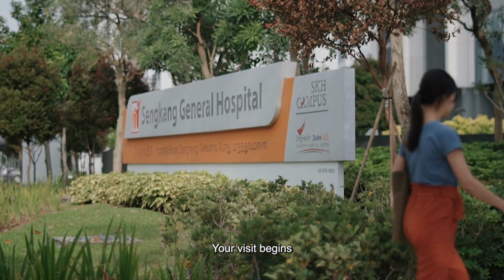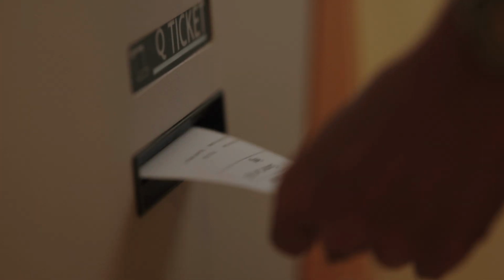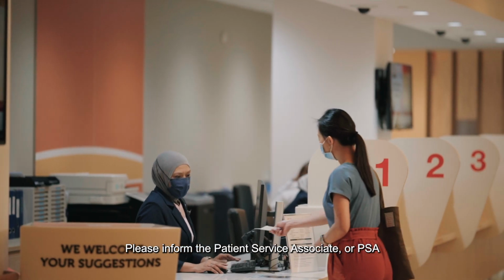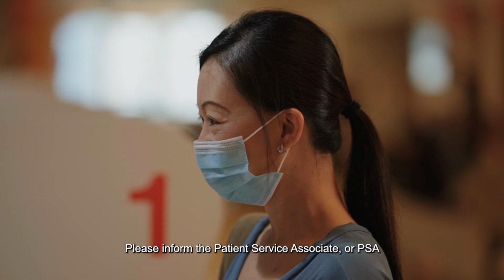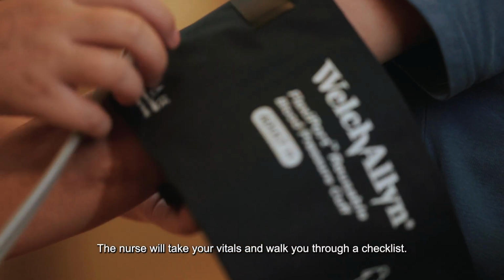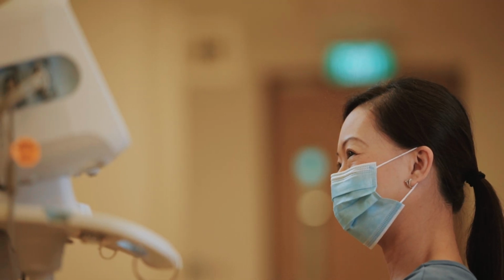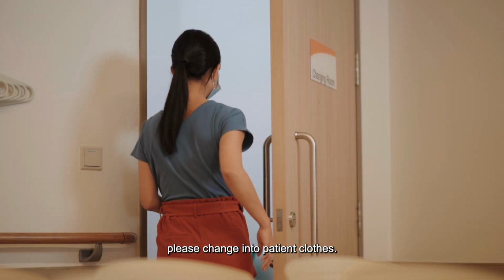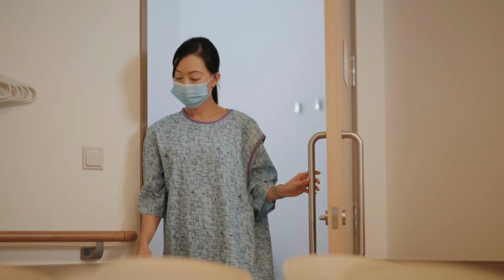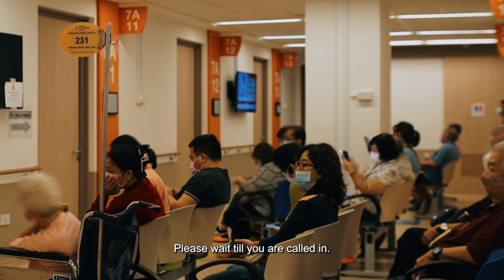Your visit begins at the self-registration kiosk or the registration counter. Please inform the Patient Service Associate or PSA that you are here for the cystoscopy. The nurse will take your vitals and walk you through a checklist. Once that is completed, please change into patient clothes. Please wait till you are called in.